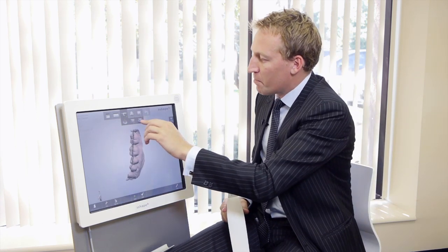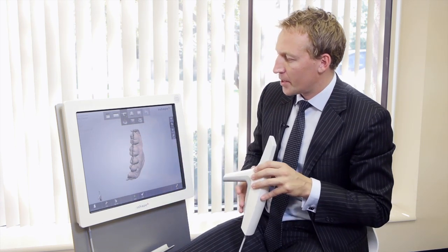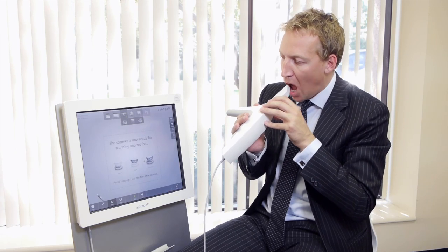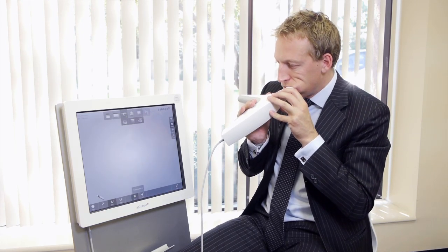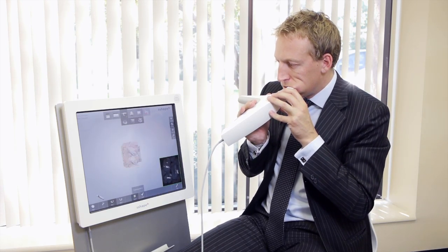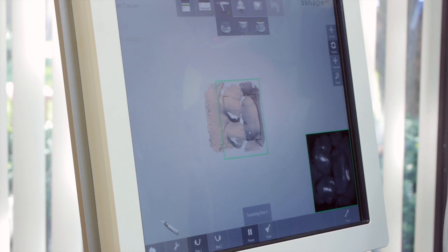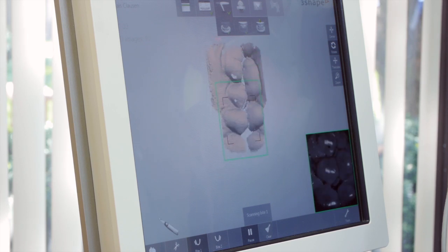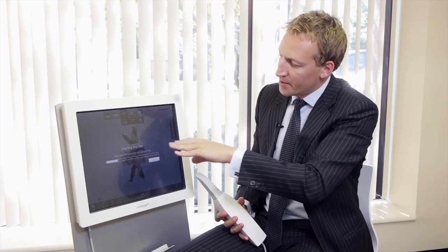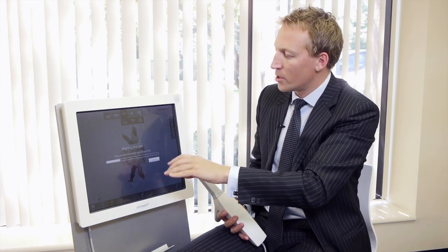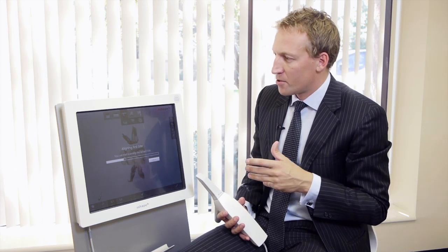And now for the bite, click over here, and for the bite you just need a little bit. So it's as simple as that. For the bite you don't need so much data, you basically need a little bit of the upper jaw and the lower jaw, and then the software is going to automatically align it.